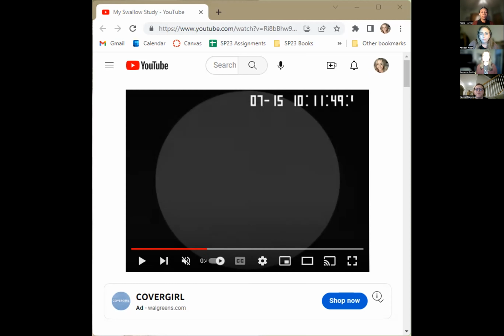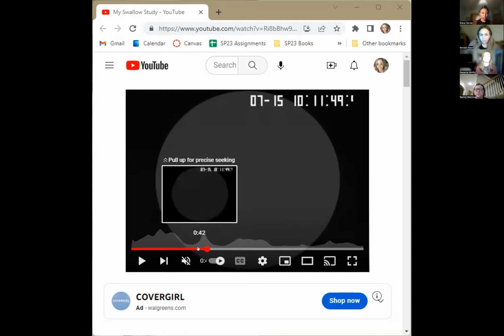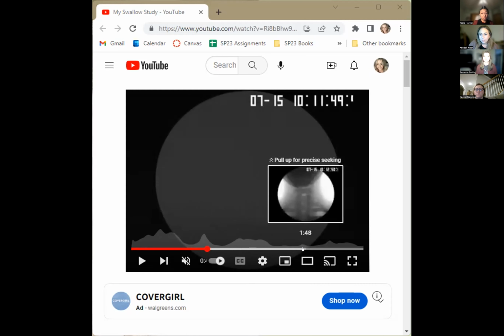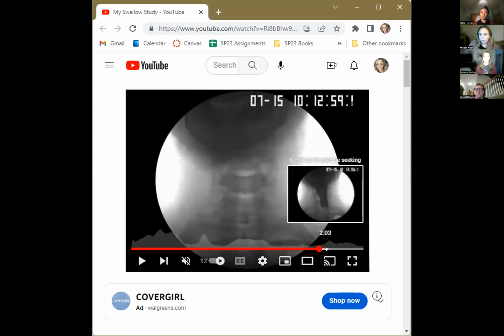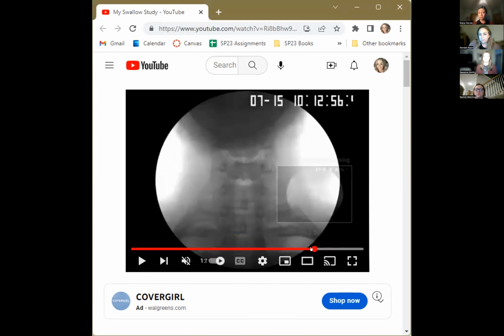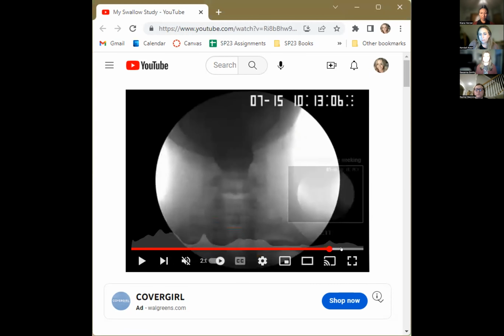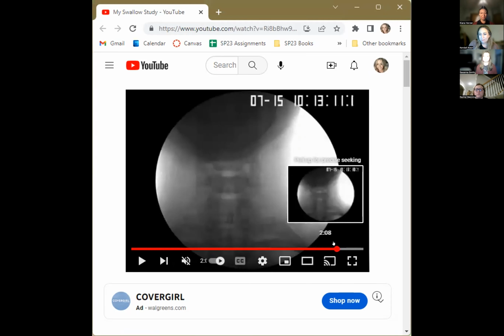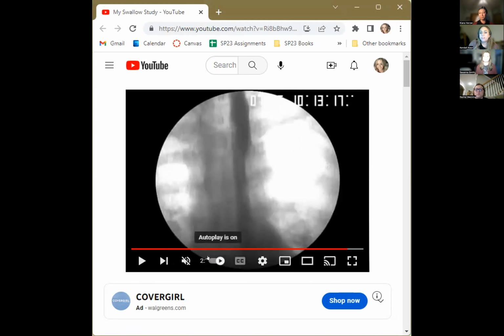Okay. So it looked like there was a large mass in her chest when you showed the view from the front. Should I be concerned? Let's see what that was. Are you talking about this part, that little black mass? Yes. Yeah, so that is actually just the food traveling down her esophagus. So that was nothing to be concerned about. It was just the barium working and showing us that process of the swallow. Okay, that makes me feel better.